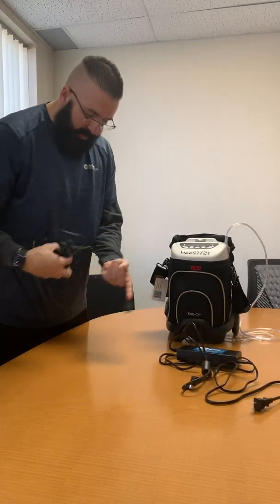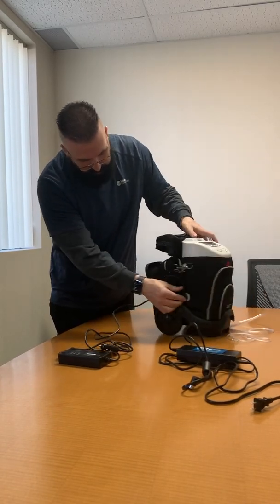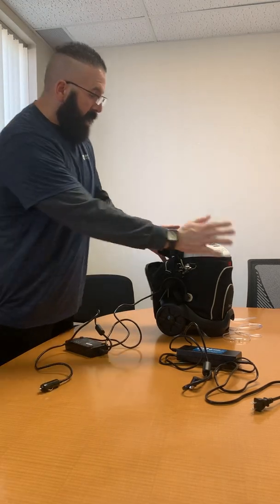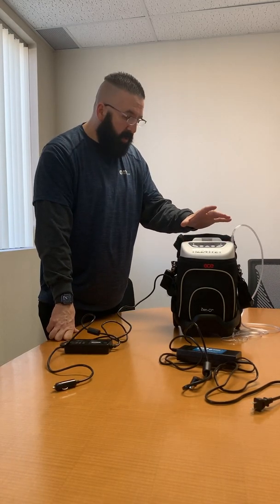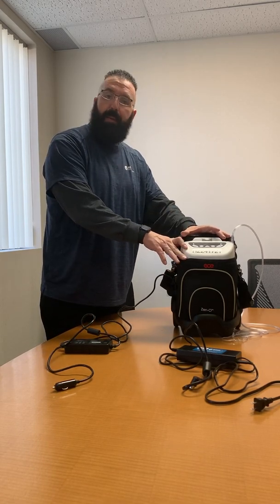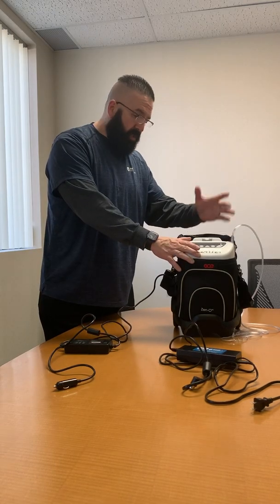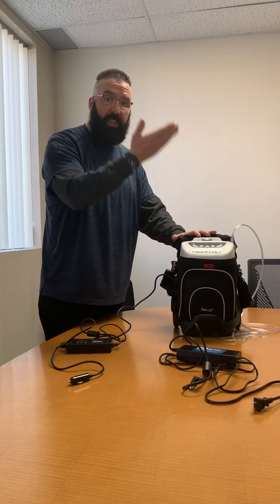The second one we have is a charger for your vehicle. This would plug in the same way over here, and then you would plug this into your car adapter that sits inside your car. I want to let you know that if you're using this at 2 liters per minute continuous, or you're using this on pulse inside your vehicle, it will not drain the battery, but at the same time, it's not going to charge this unit up for you if you're doing them both at the same time. So if you leave your house and this is set at 80% capacity and you drive for a little bit of time and this is plugged in, the battery won't drain on there, but it's also not going to charge it and bring it back up at the same time.